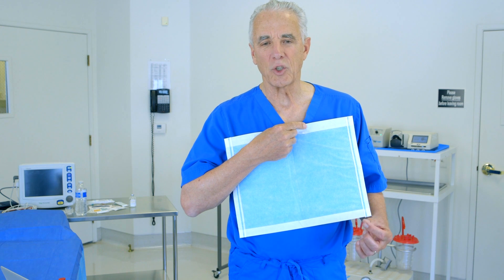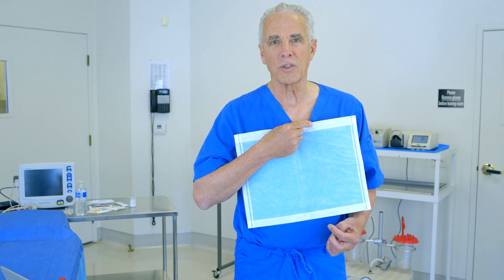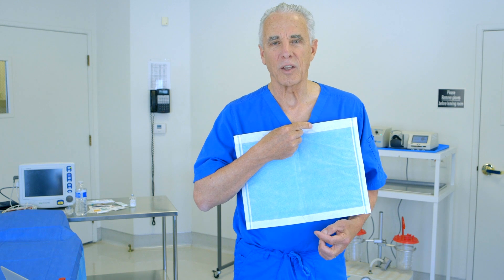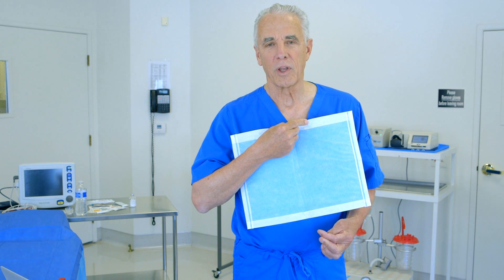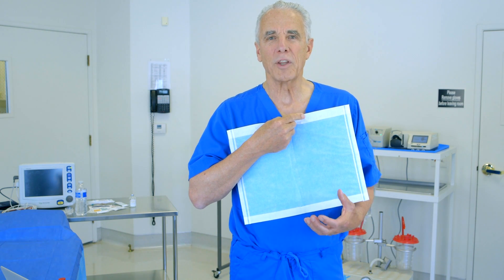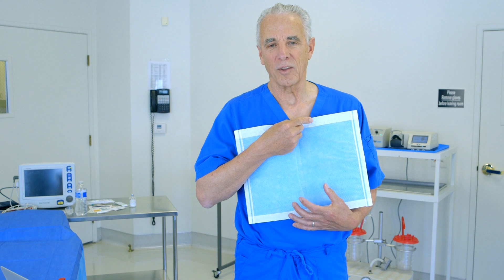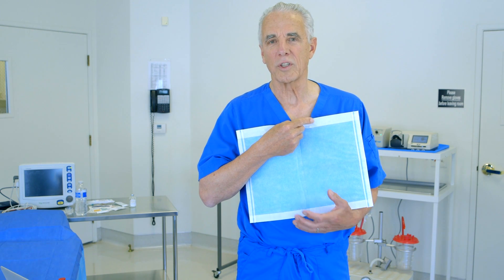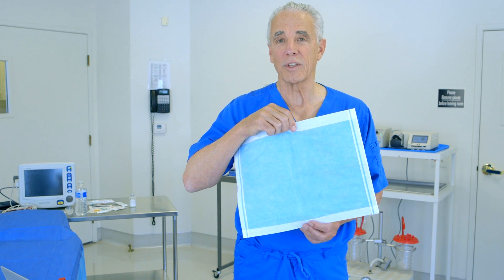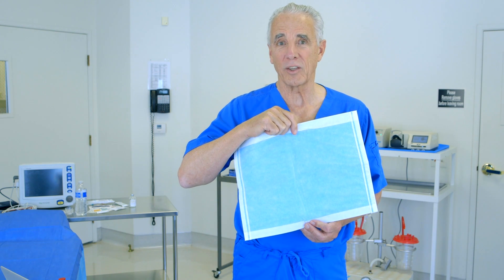Some surgeons will put sutures in their incisions after liposuction to contain the drainage, but that simply prolongs the inflammation of the tissues and swelling and edema, soreness and discomfort. By allowing and encouraging a maximum amount of post-operative drainage, that blood-tinged anesthetic solution is collected on these pads and the swelling and post-operative edema and soreness dissipate much more quickly. So it is a big advantage to use this, but in order to do this technique with open adits and open drainage, you need to have padding to collect the fluid.